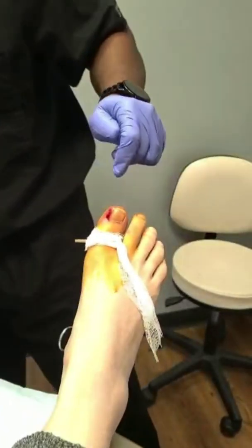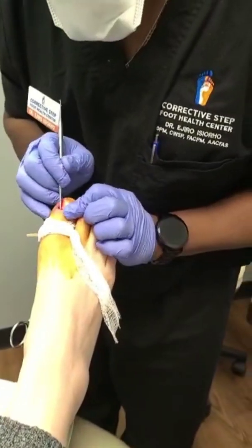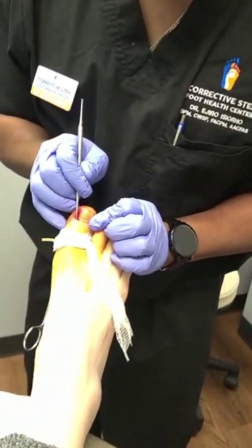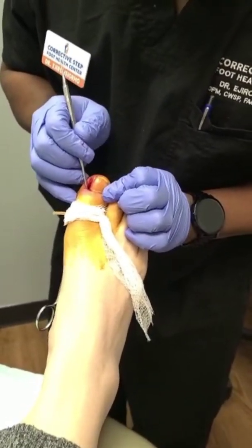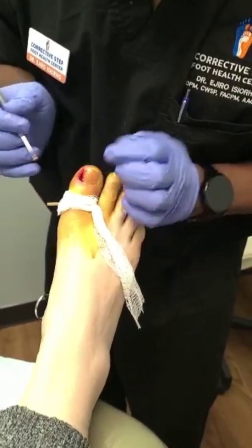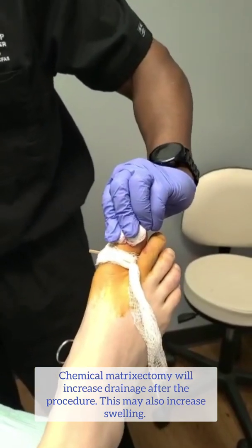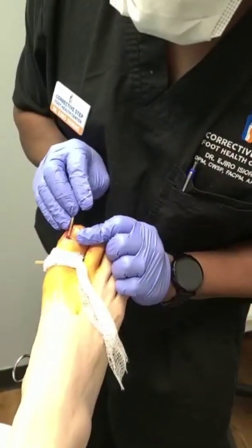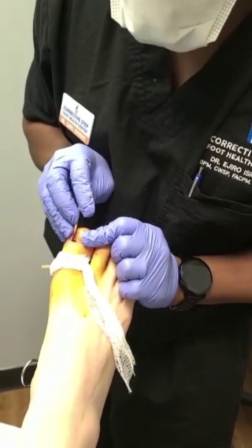Very good. Now we're ready for the actual chemical burn portion. Now we're scoring that nail matrix — this is where the actual nail grows — so we're going to put some chemical back here so it won't grow back. When I say scored, I'm actually increasing the surface area so the medication penetrates and works a little bit better. If you ever have a chemical matricectomy, you're going to expect more drainage from your toe and the procedure site because we're actually causing a chemical burn.